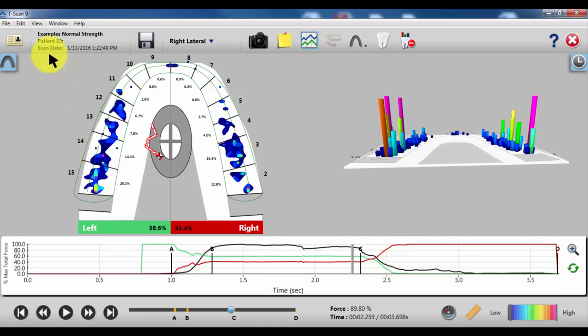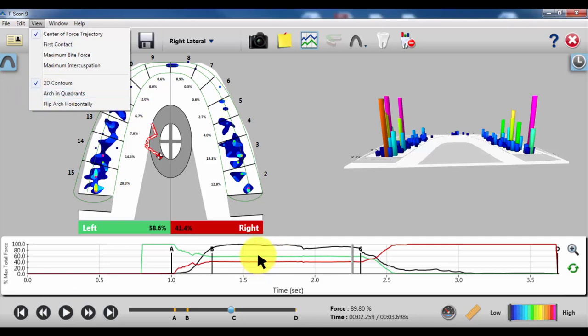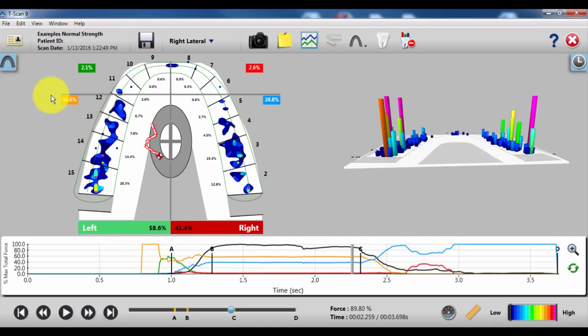The best way to do that is go up to View, Arch in Quadrants. What you'll see is when I click this, instead of a red and a green line on the graph and a left and right side that are left green, right red, it'll move into a quadrant view. So there will be more colors.